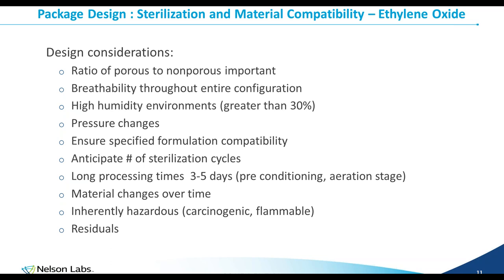It has long processing times. It could be 3 to 5 days, so it is not a quick sterilization method. It is hazardous again. Again, carcinogenic and flammable, and you have to worry about residuals.